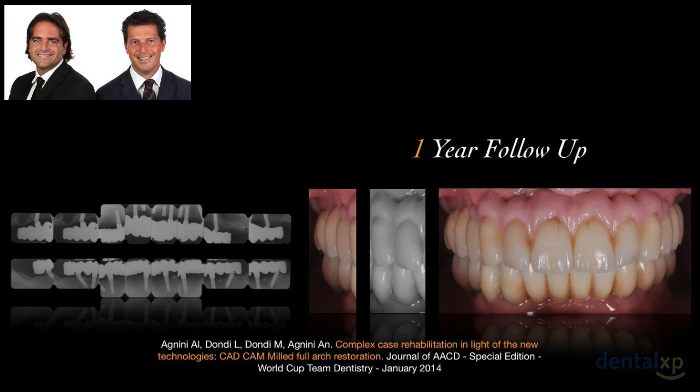And this is the 1 year follow-up. You can see it's always important to have the static black and white full mouth x-ray, because we want to see if everything is working well, and of course taking some intraoral pictures.